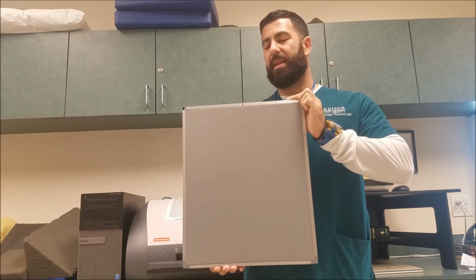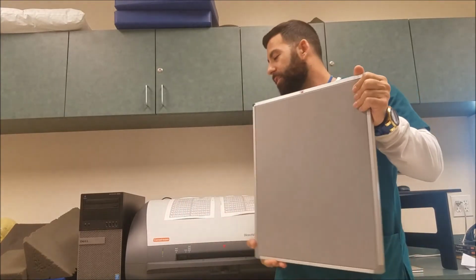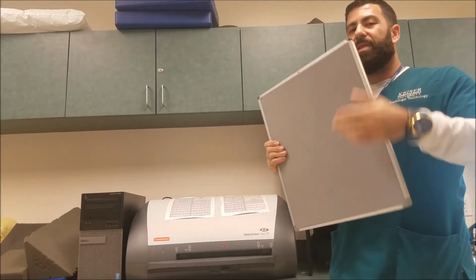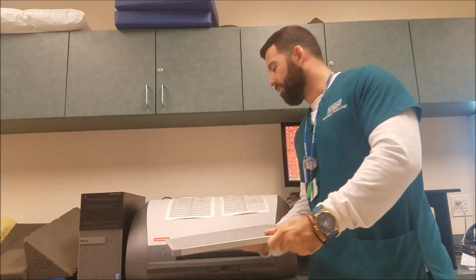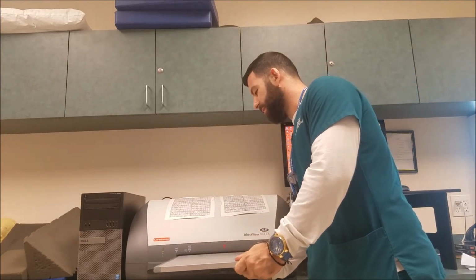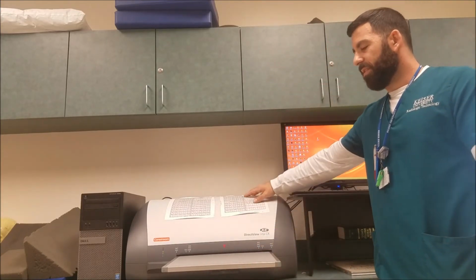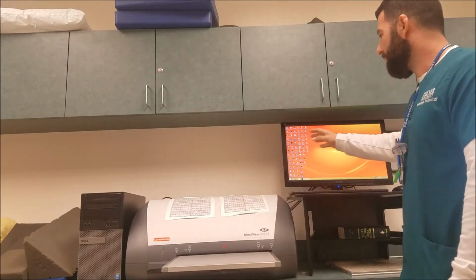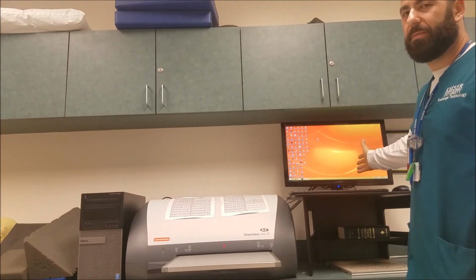Once this cassette obtains an image, we will then process it using the CR processor here. To do this, we place the cassette with this end into our CR processor, like this. Once inserted, the processor will read the image, process it, and we will be able to display it here for evaluation on our monitors.